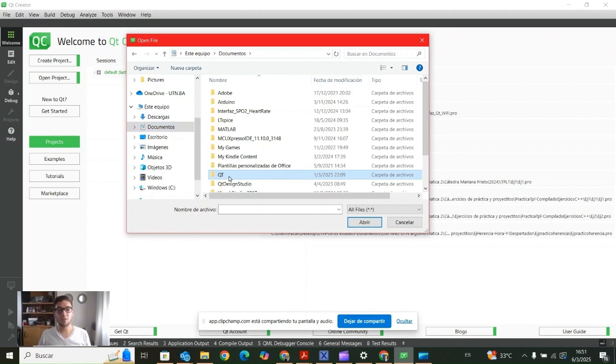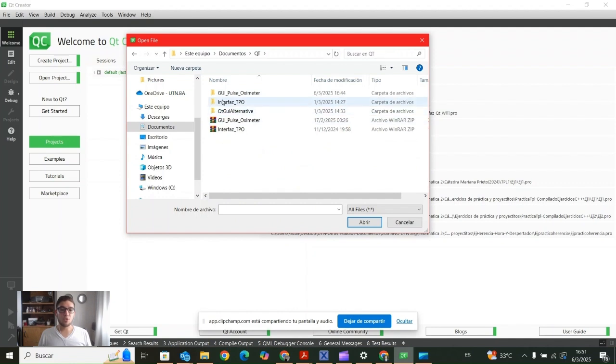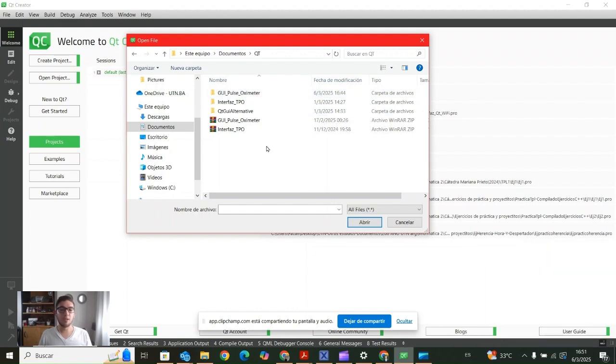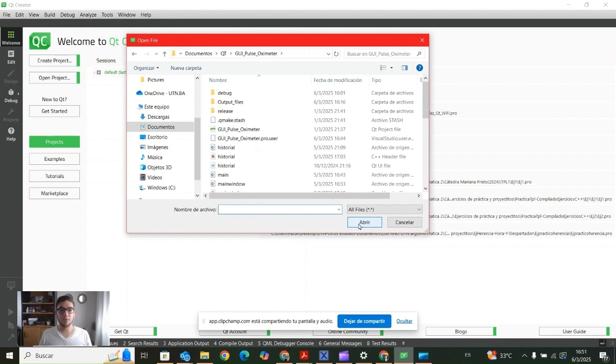Okay, now we enter. We choose the graphic user interface pulse oximeter. This is a name that I created within another folder. All the folders and files are already uploaded to GitHub. So when you download it, I suggest you maintain the same names, just to not have any kind of problems. Okay, so we enter this folder and we are going to choose the .pro file.